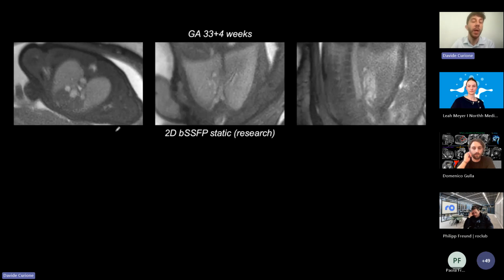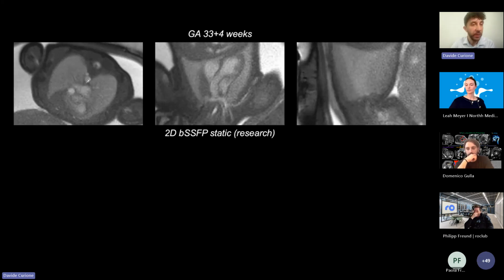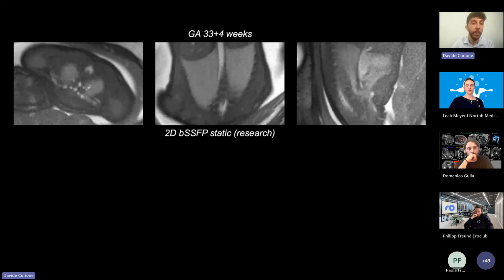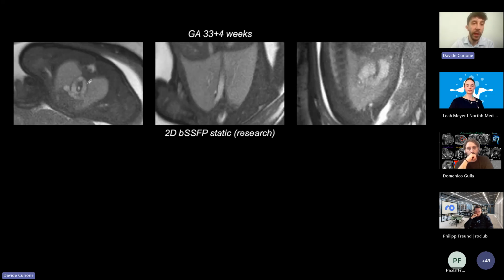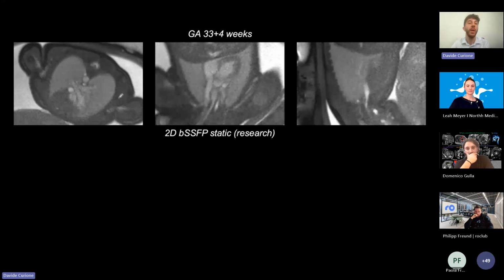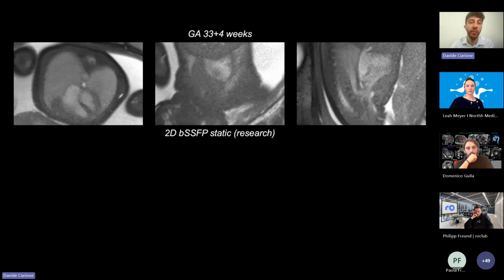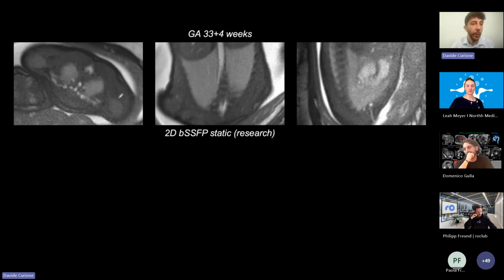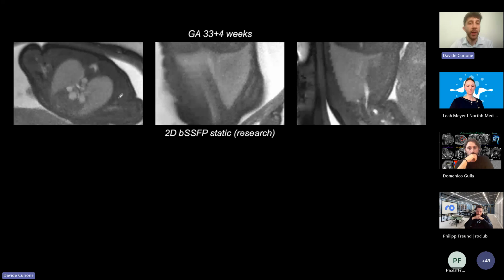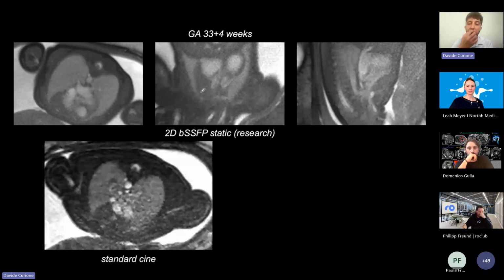An MRI clearly demonstrates that there is a left posterior ductus, but the imaging pattern has a left subclavian artery that comes off from the left, and this could be an aberrant left subclavian artery or an isolated origin from the duct, but we couldn't confirm this differential diagnosis because this was a very recent case and the child hasn't been born yet.